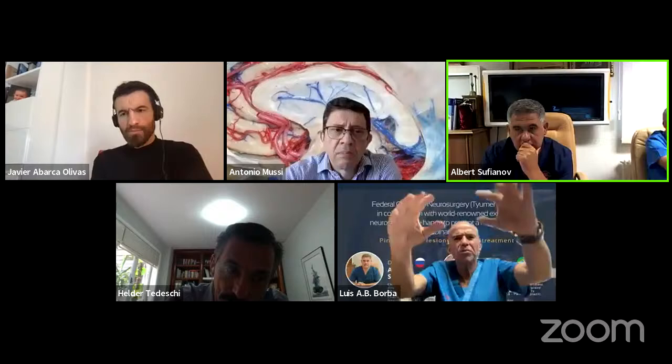And I think it's a good idea to use the exoscope when you want to use the supracerebellar infratentorial approach. The big problem is working like this with the microscope. See? In 2 hours, you'll be like this. With long instruments, your instrument will be like this. See?